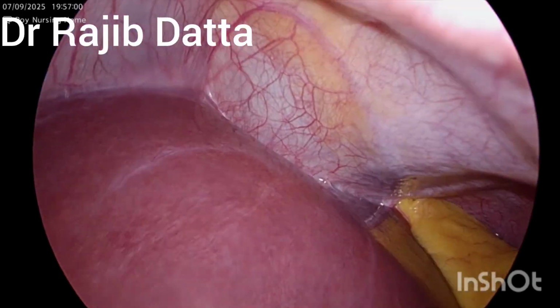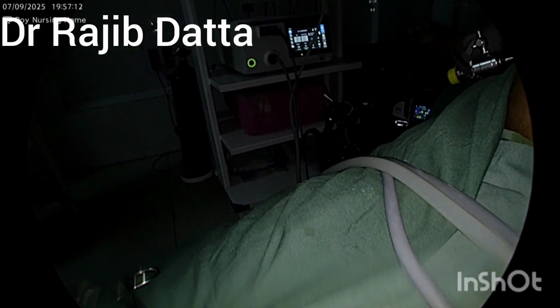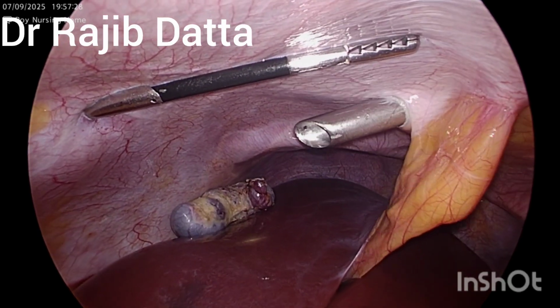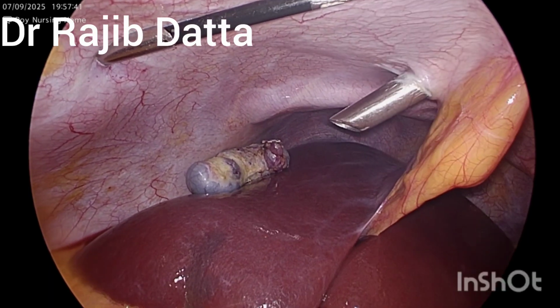You can well appreciate that it's the spleen that has been shown on the left side of the hypochondrium. You can well appreciate that. It can be seen through the 30-degree telescope. It's almost a bloodless surgery.